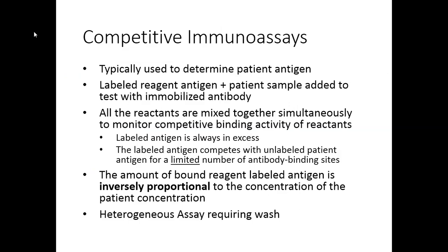Why do we do that? Because we want all these immobilized antibody binding sites on the test well to be filled up. We want a true competition. We don't want to leave some empty binding sites. So labeled antigen is always in excess, so we know that this test can run to completion.